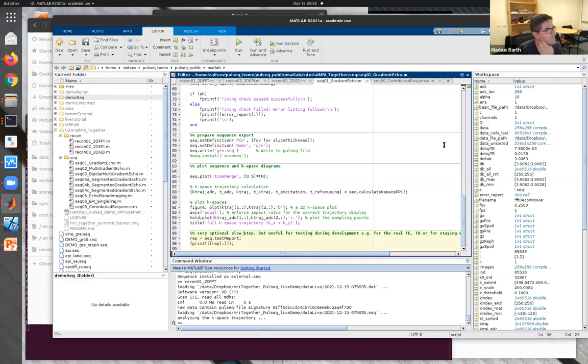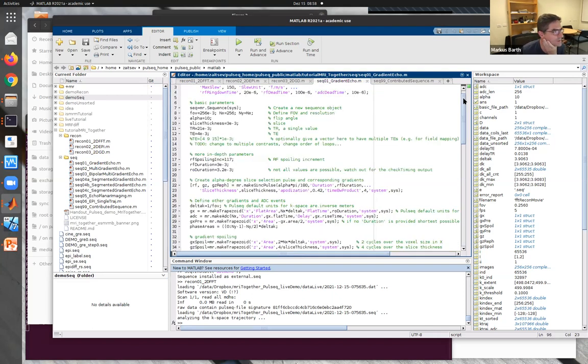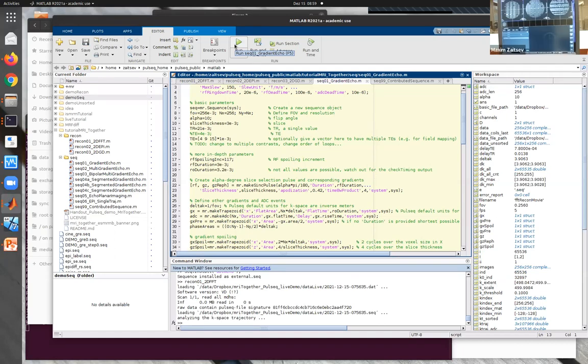If I might just take the question that I put in the chat as well, Maxim. Yeah. Thanks for the demo. I'm just wondering, you opened the parameter card on the scanner. Can you actually change single parameters like TE or TR on the scanner, or is it something you need to run through the? No, you can't change any TE or TR.